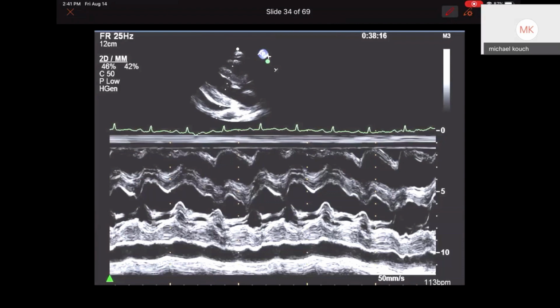All right, so let's take a look here. Do you guys see anything? So this is hard because I don't have a respirometer here, but do you notice this? So this is our right ventricle, right? There's variation, I think, with the respiratory cycle. Good. So that's a great pickup. So something's abnormal between here and here. We see that, and it corresponds with our right ventricle, right? So something is changing in our right ventricle during something happening.